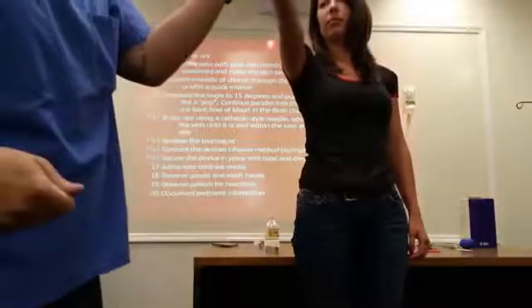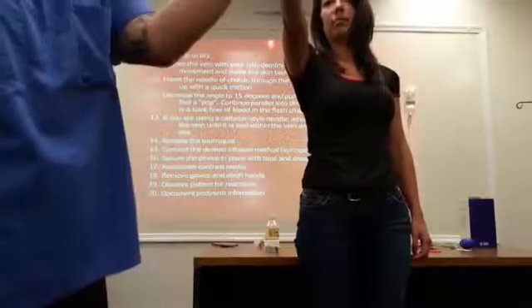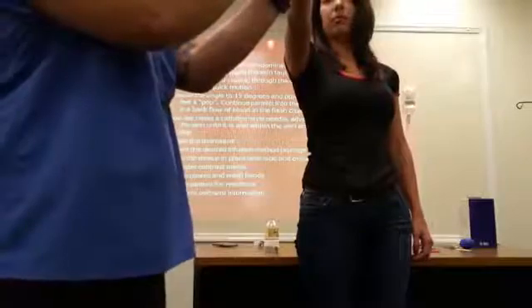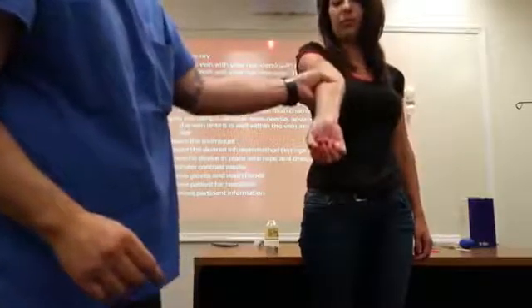If you have a vein and you're accessing it and it moves around, I'm going to take my non-dominant hand because I'm going to have my needle in my right hand. To prevent the vein from moving, I'm going to make the skin taut by using my thumb and pulling on the skin or the vein so that when I stick it, it doesn't move. If I stick it, look how it likes to move around. If I make it taut, do you see anything moving? Same thing here. If you were going to stick the arm here, you're going to pull on the skin to make it nice and taut.